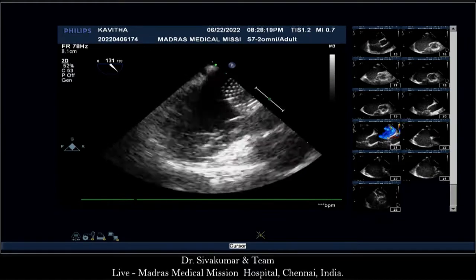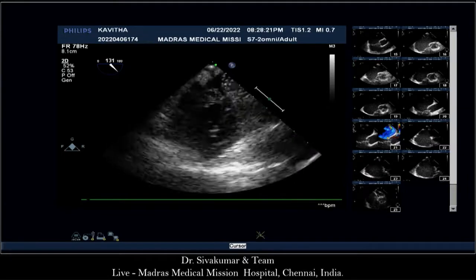Shaq, you are conducting an echocardiogram exam for me. Yeah, yeah. You didn't think I could do this. Okay.